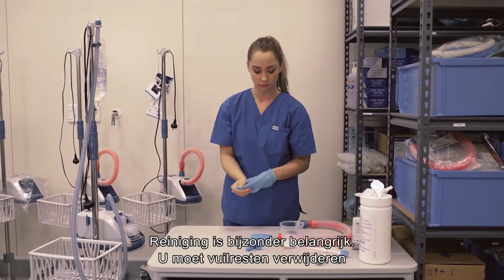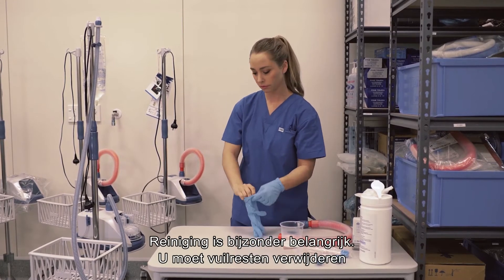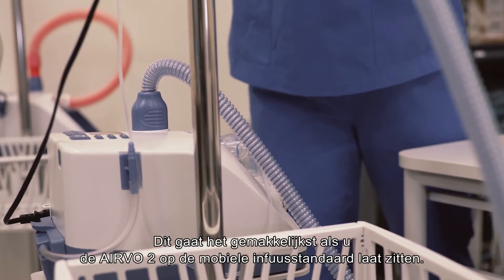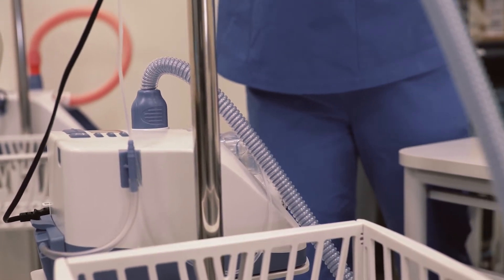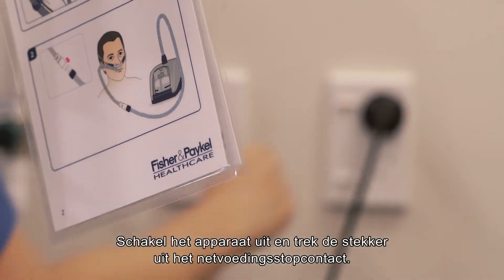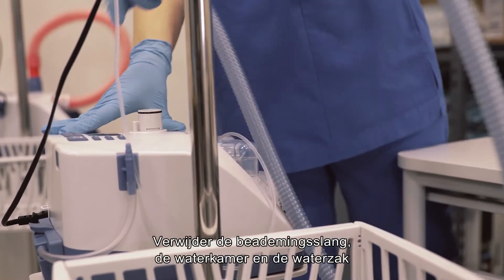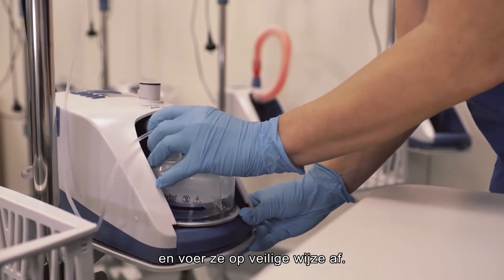Cleaning is particularly important. You need to remove debris so that disinfection works effectively. It's easiest if you leave the Airvo 2 on the mobile pole stand. Switch off the unit and unplug from the mains utility power socket. Remove the breathing tube, water chamber and water bag and safely dispose of them.